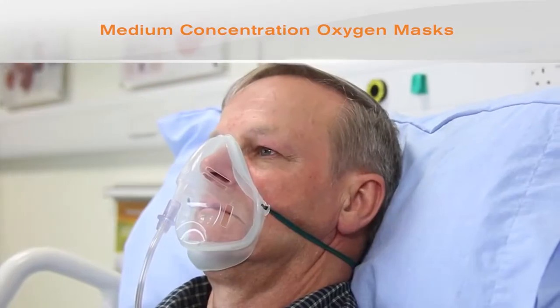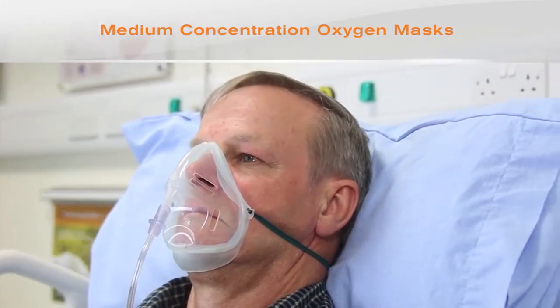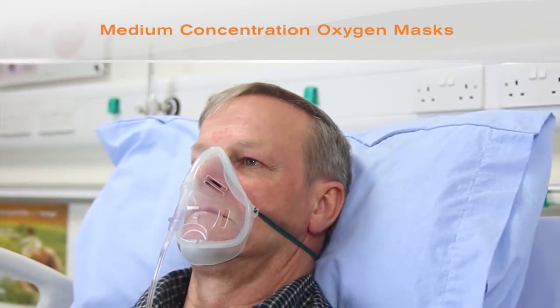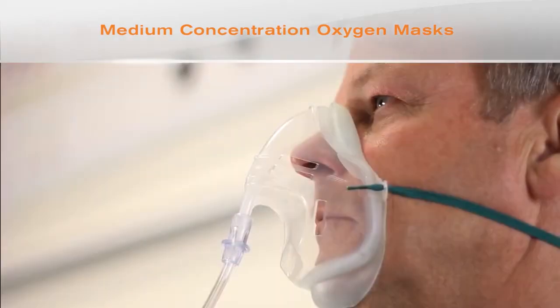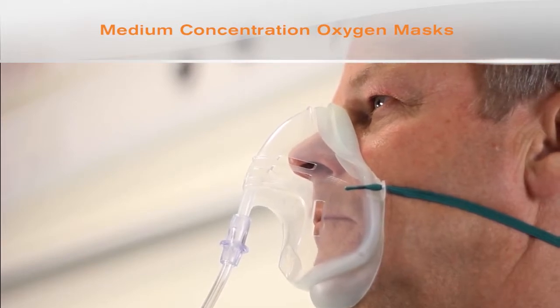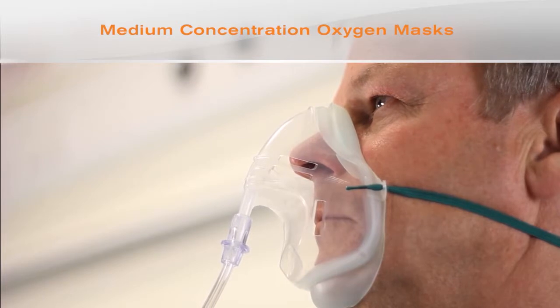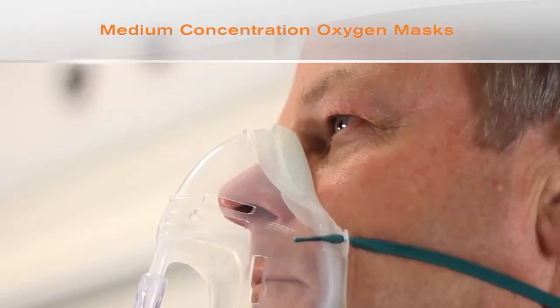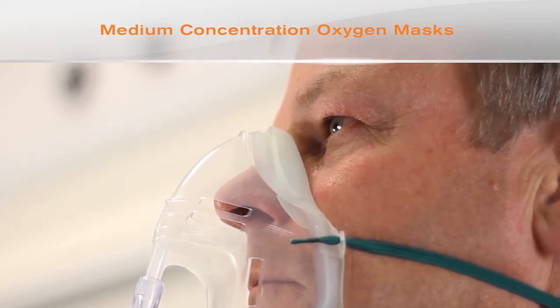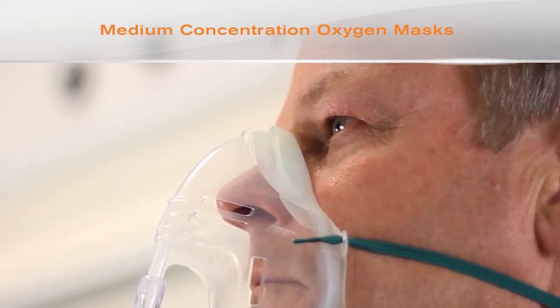However, new generation Intersurgical Ecolite oxygen masks can also be secured under the ears to avoid the occurrence of pressure sores. It is important to use a mask which obtains a good seal on the patient's nose to prevent oxygen entering the eyes. A poorly fitting mask can expose the eye to a high flow of dry oxygen, which can result in exposure keratopathy, which then may lead to corneal perforation.